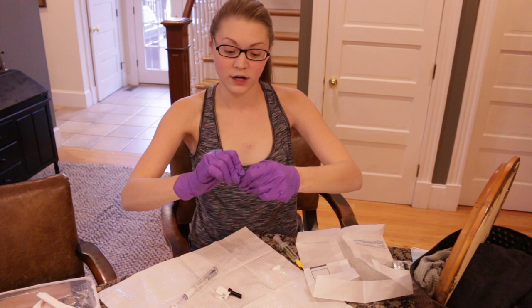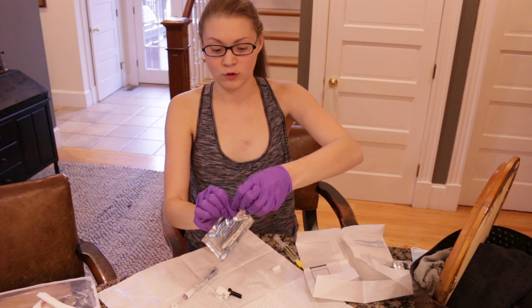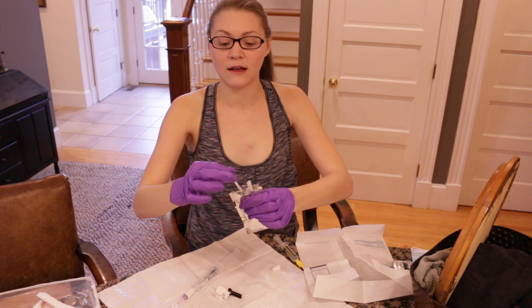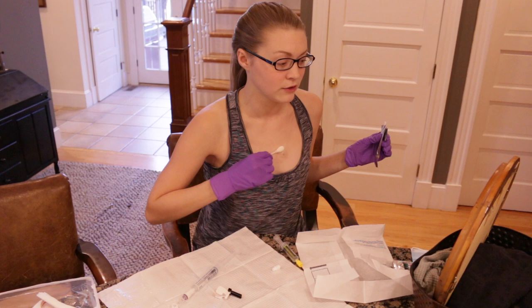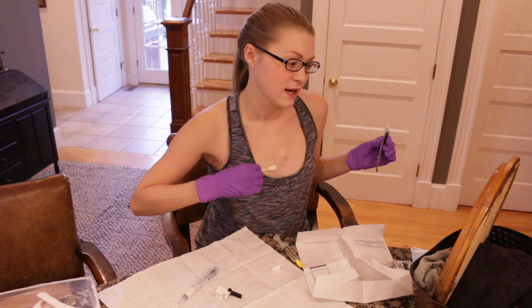Just remember that nothing goes on the sterile field that isn't sterile. I'm opening up the swab package — apparently it's really hard to open. You may have these little swabs or you may have a chloroprep wand; I prefer those, but this is what I have. I'm going to go ahead and look in the mirror because it helps me see. This is how I've done it and it works well for me — I just start at my port and work my way out.